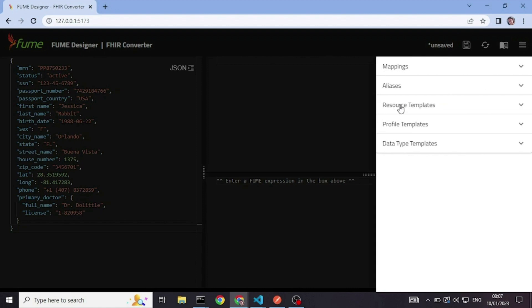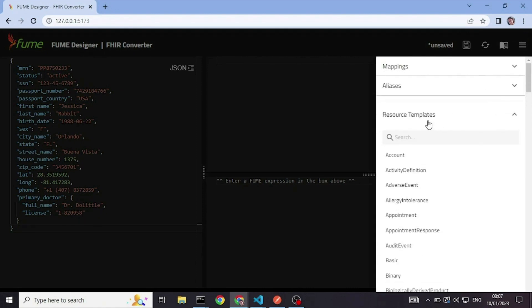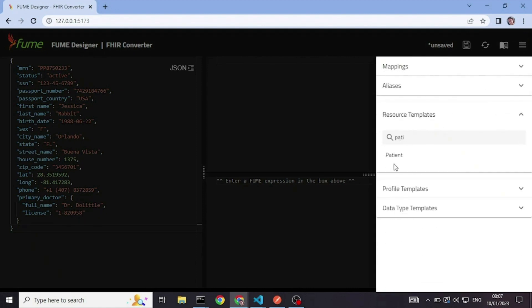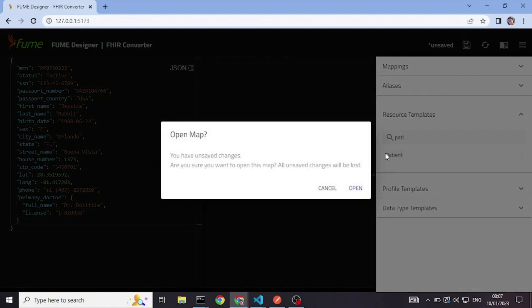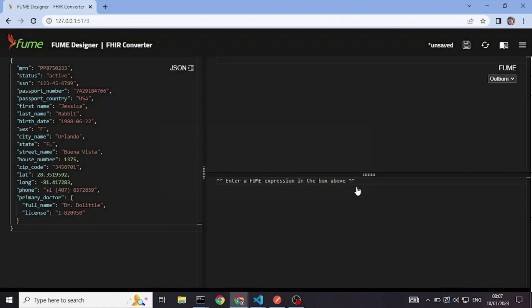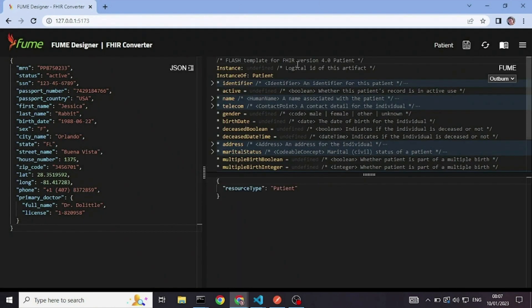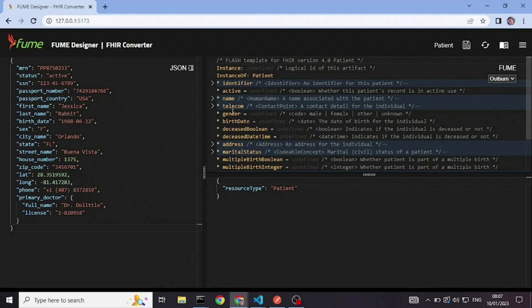So I will open the patient resource template. And I will start filling in the data. What you see here, this syntax is based on FHIR shorthand, but the main difference is I can put field names here and not only static fixed values.